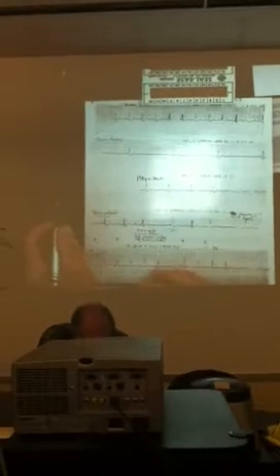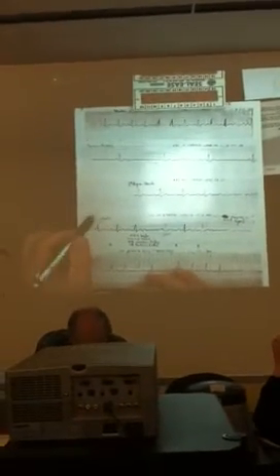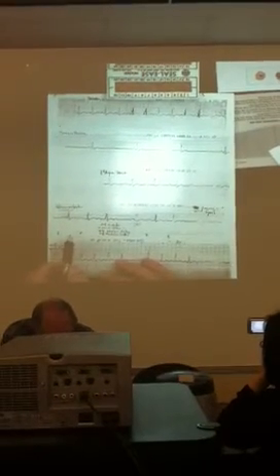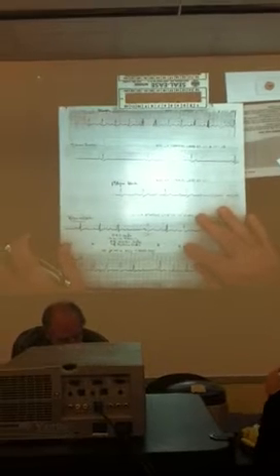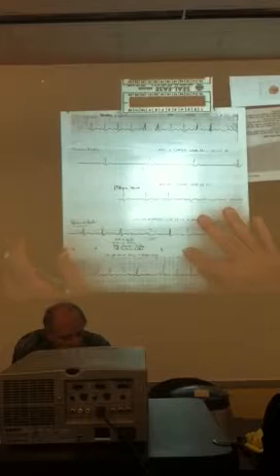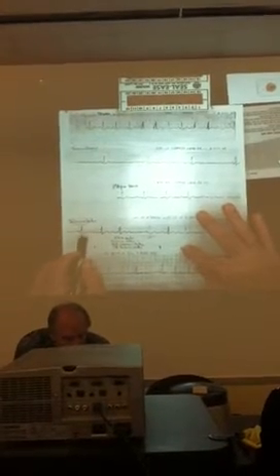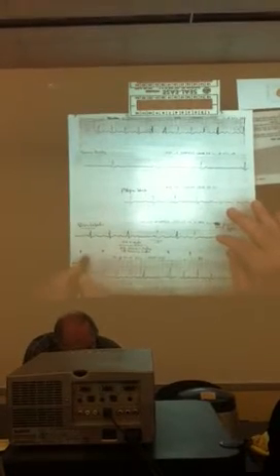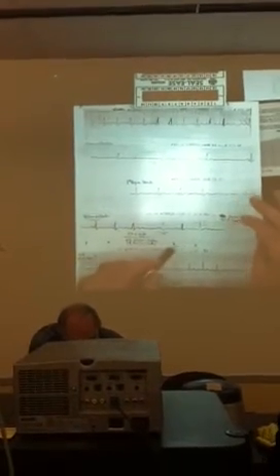Now, Brenda, we're going to calculate this heart rate by counting. Here's what you do. You have to remember one simple mathematical formula. We get 5 seconds. 1, 2, 3, 4, 5. All right, so you multiply the number of R peaks. Pardon me, I'm sorry, it should be 6 seconds. You should have 6 seconds.